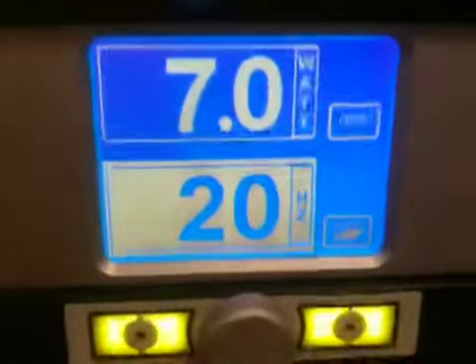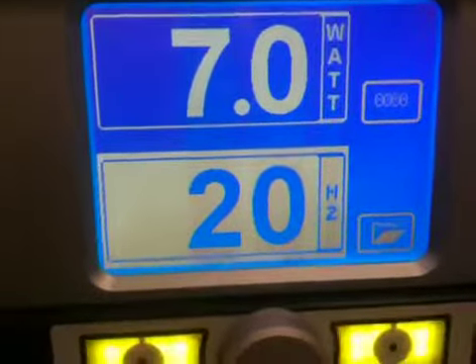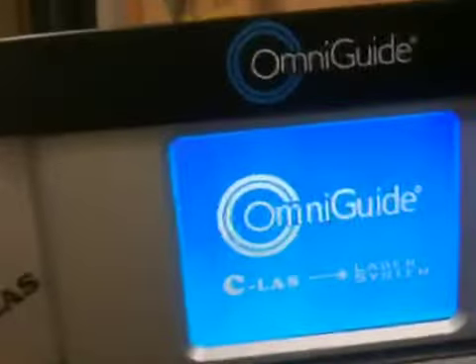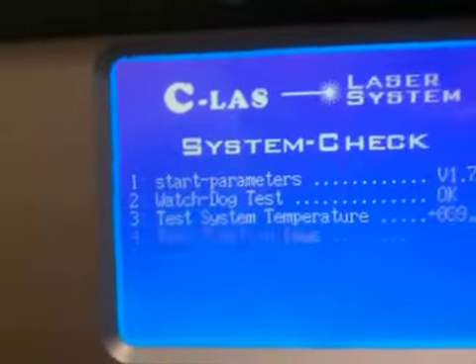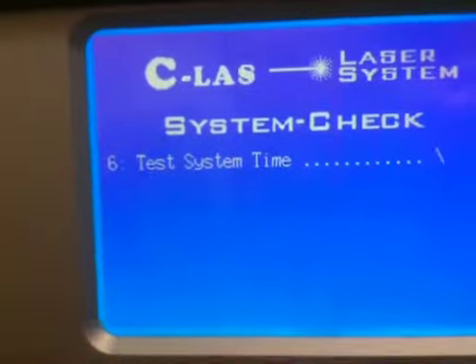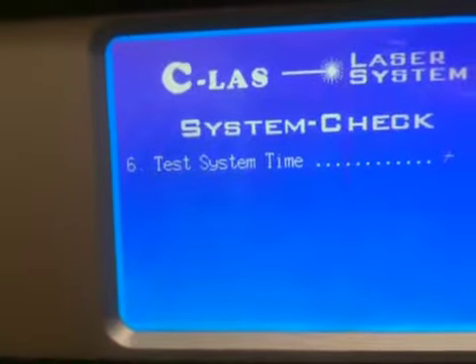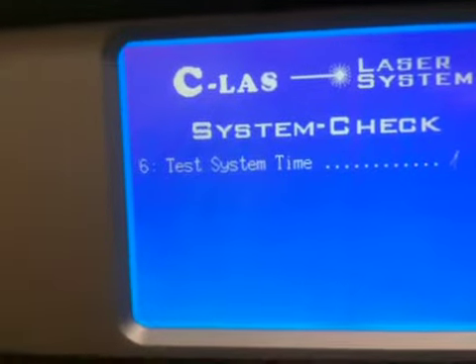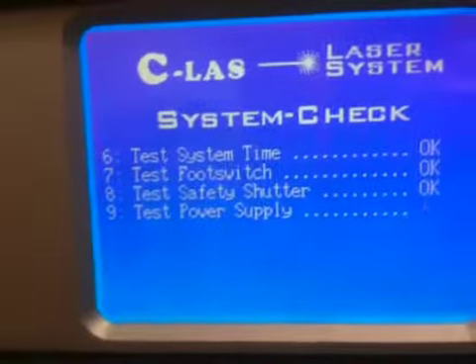Okay, and now, assuming that the laser is actually shut down now, I restart it. So we restart the laser. This is running version 1.7, and just to remind you, we started with 1 watt CW. I switched to 7 watts, 20 hertz. I fired, shut the system down, and restarted it.